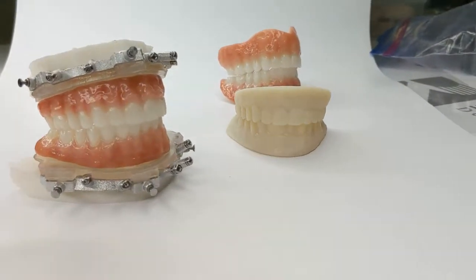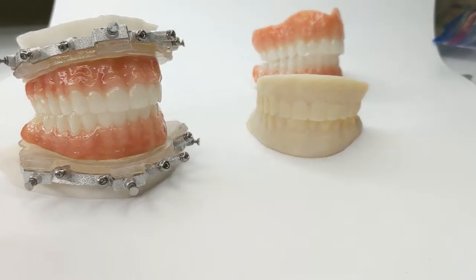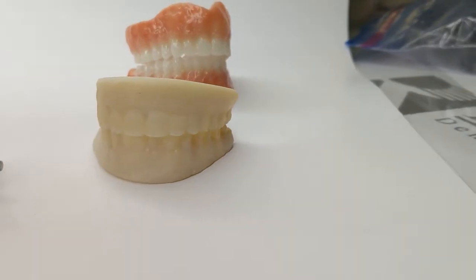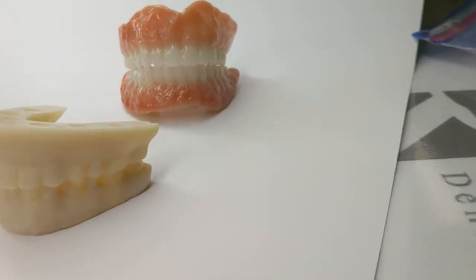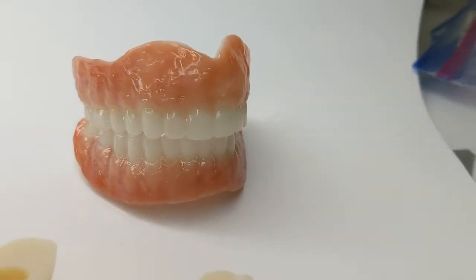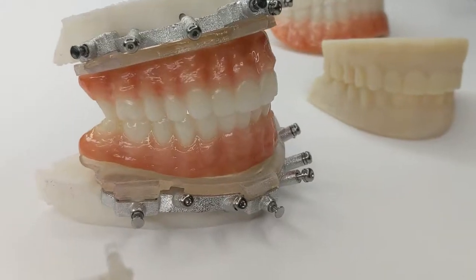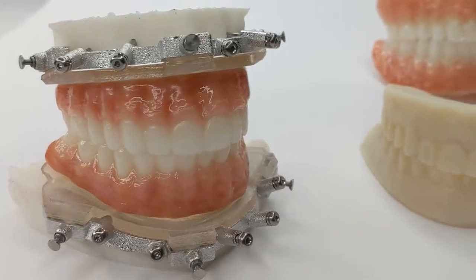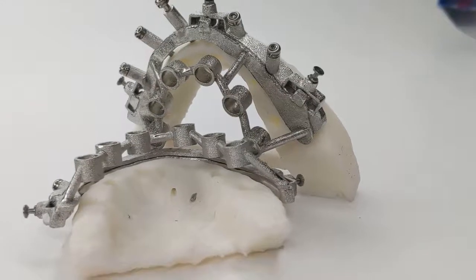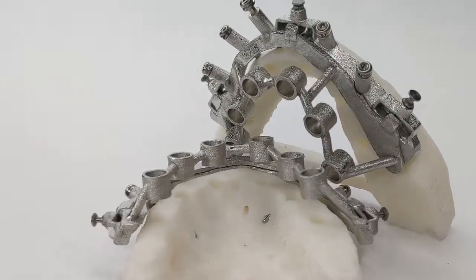This is the case we were just showing, where we were sending a pin guide, which was the first image, and then the surgical prosthetic, second image. Here are the rapid appliances, and here are the backup dentures. The doctor wanted conventional dentures as one backup, but then also the milled PMMA dentures. And then here are the osteotomy guides and fixation bases.